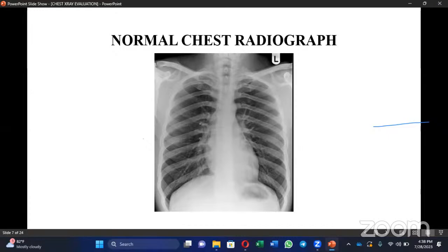All right. Then we moved on to area, where we talked about whether all the relevant anatomy is included within the chest radiograph, okay? We said we look at the superior border, the two lateral borders, and then the inferior borders of the image.